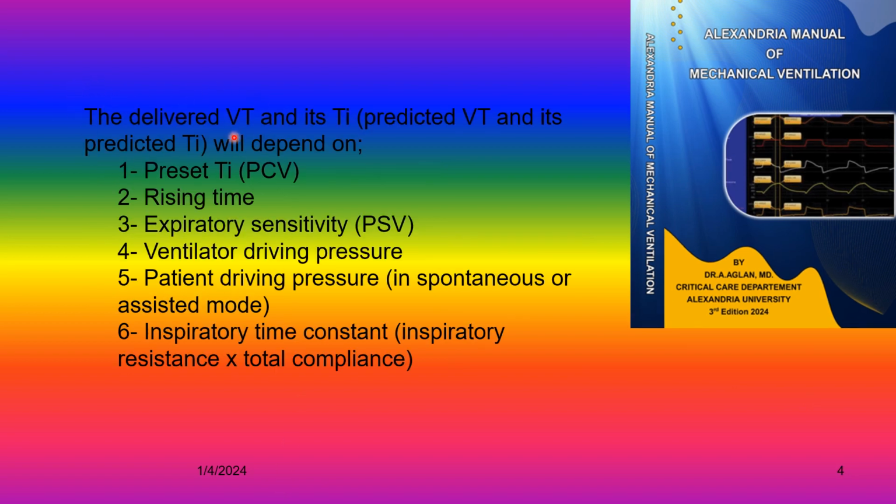The delivered tidal volume and its inspiratory time, we can call it predicted tidal volume and its predicted inspiratory time, and this depends on the preset inspiratory time as in pressure controlled ventilation, the rising time, the expiratory sensitivity as in pressure support ventilation, and the ventilator driving pressure.